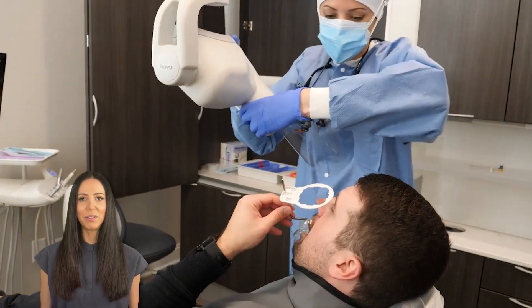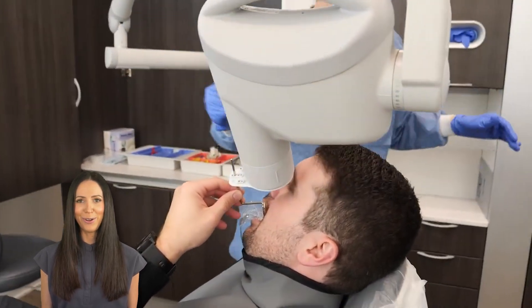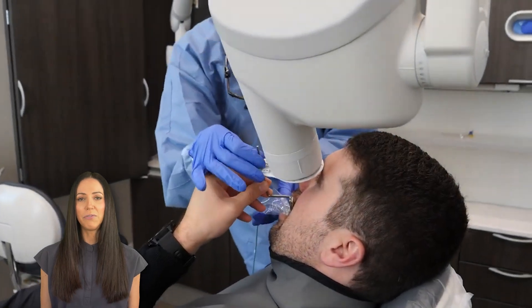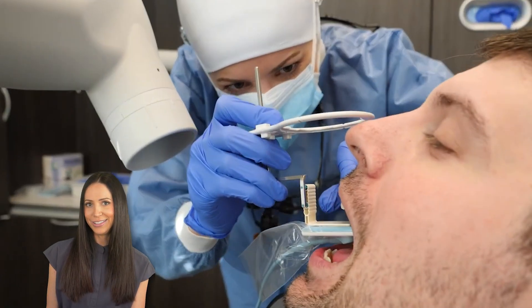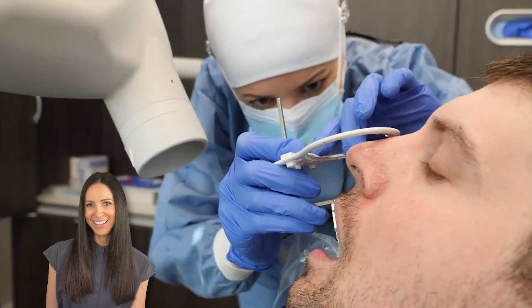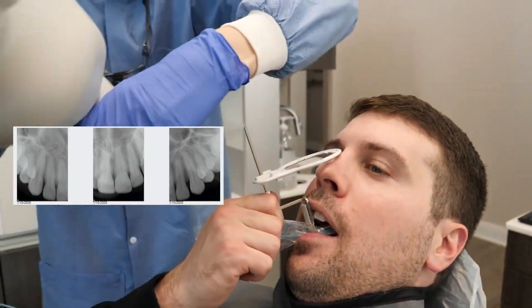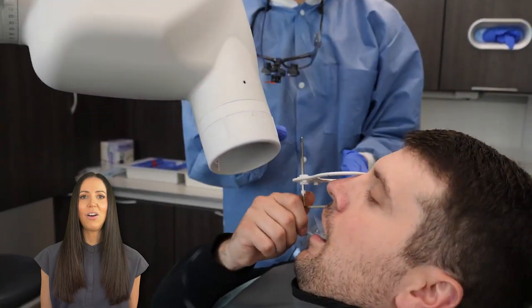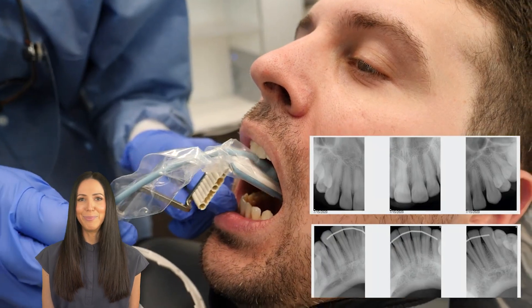Every clinician may take a full mouth series of images in their preferred order — there is no right or wrong order. What I tend to do is take all of the front teeth first, also known as the anterior teeth, which as you can see I've already started. There are three images on the top for the upper front teeth and three images on the bottom for the lower front teeth.